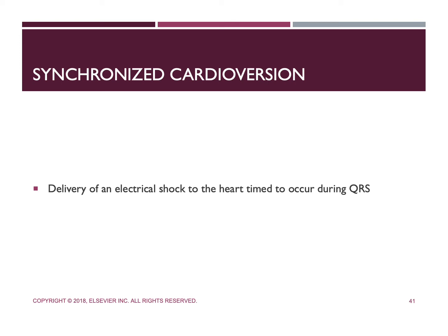It could appear as an oval, a square, a line, or a heightened triangle on the ECG display, that flag that we're talking about. To deliver a shock, you press and hold the shock button on the defibrillator until a message appears on the screen indicating that the shock has been delivered. With standard paddles, we press and hold the shock control on each paddle until the message is seen. It really depends on the machine you're using, but that is typically how a synchronized cardioversion is done.